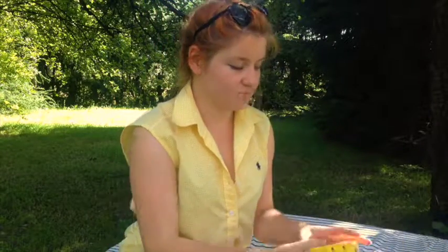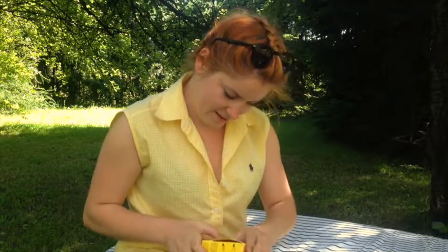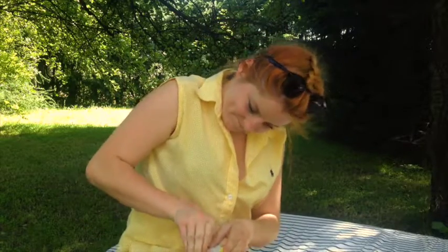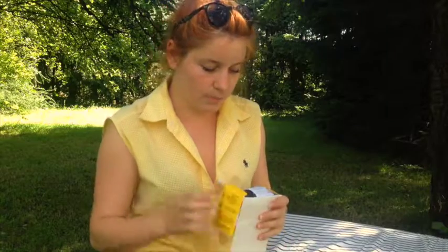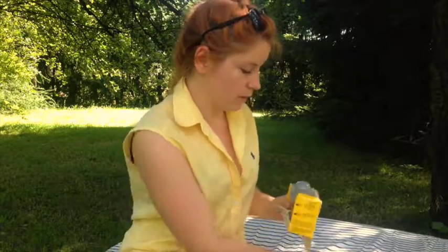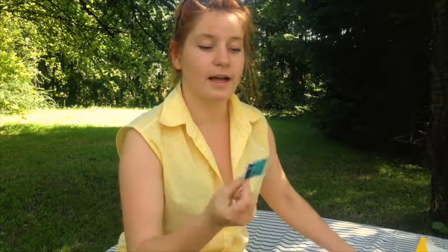I zacznijmy od tego, że zamontujemy go. Mamy oto takie piękne pudełeczko, które trzeba trochę rozerwać. W pudełku znajduje się instrukcja obsługi, znajduje się serter, który będzie nam potrzebny, znajduje się sensor do Freestyle Libre i mała chusteczka, którą przeczyścimy wybrane miejsce.